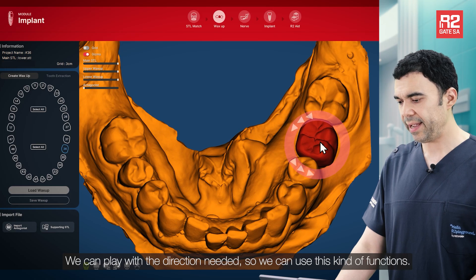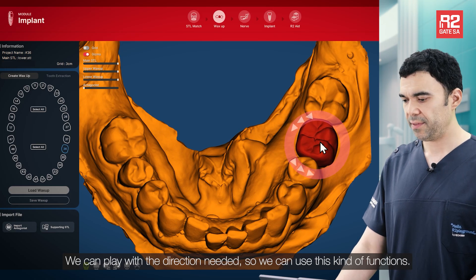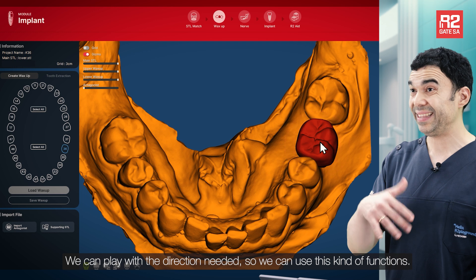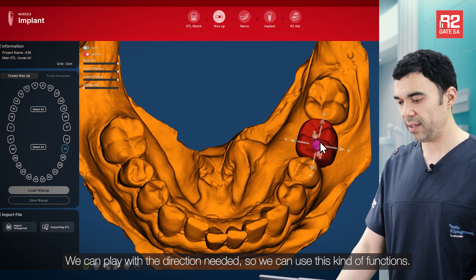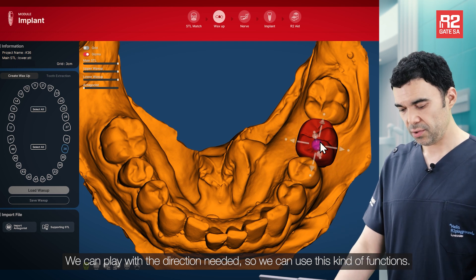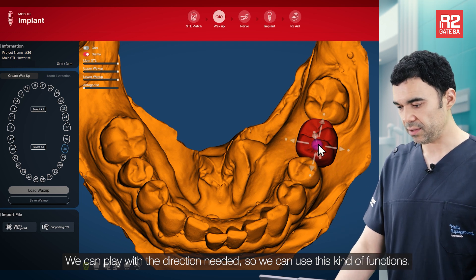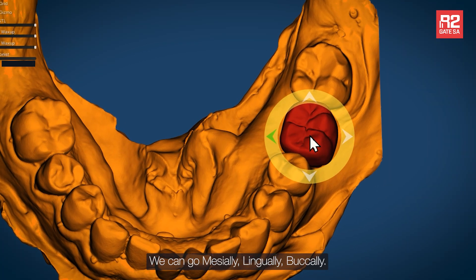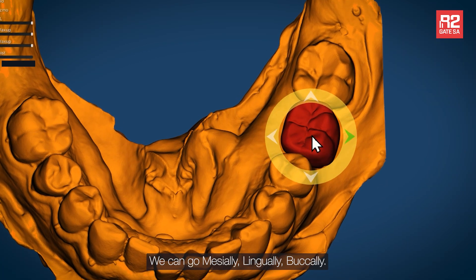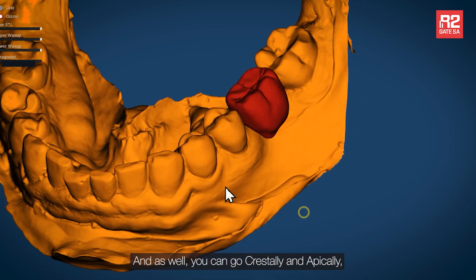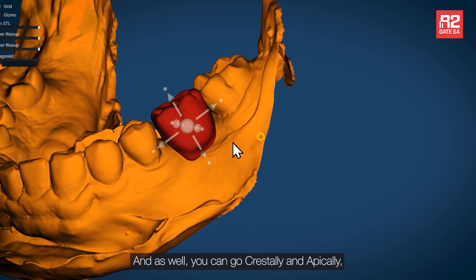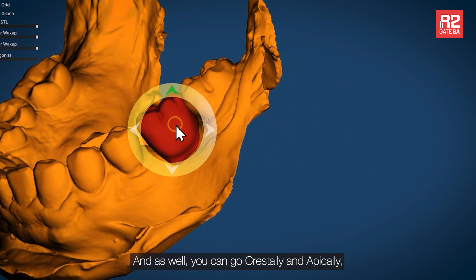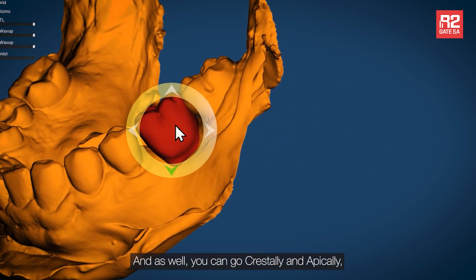We can adjust the direction as needed using these functions. We can go mesially, lingually, buccally, and as well crestally and apically.